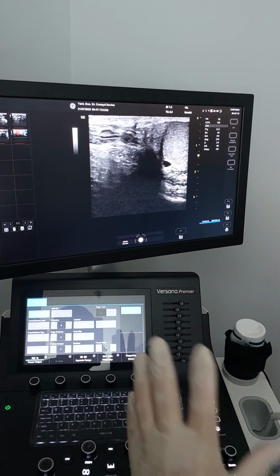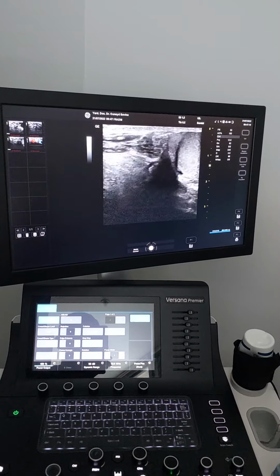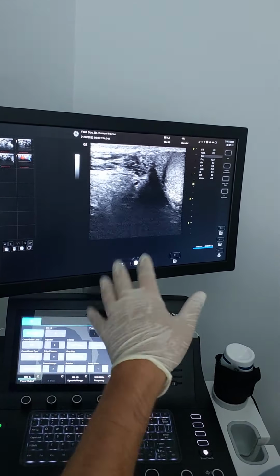Okay, now we have a very big left-sided varicocele. In the examination, I love to use this Doppler ultrasonography device because I don't want to send the patient to the radiologist and wait for the results. And they are looking at patients in the laying down position. I don't like it. I look at it by myself.